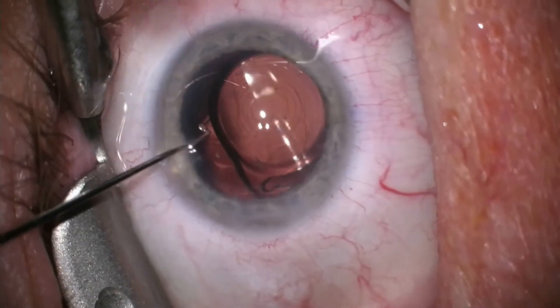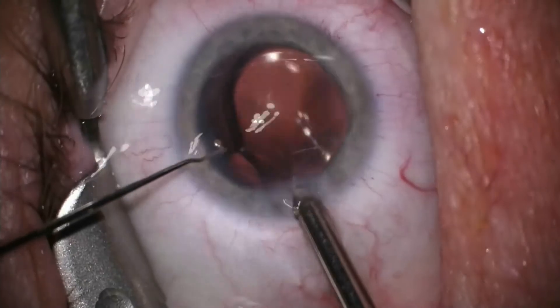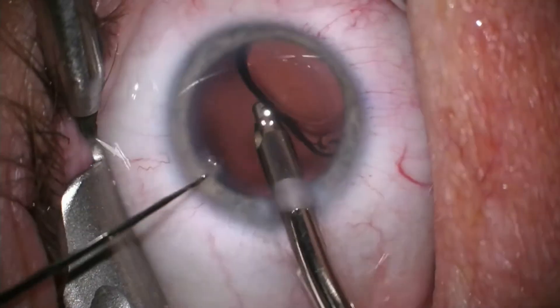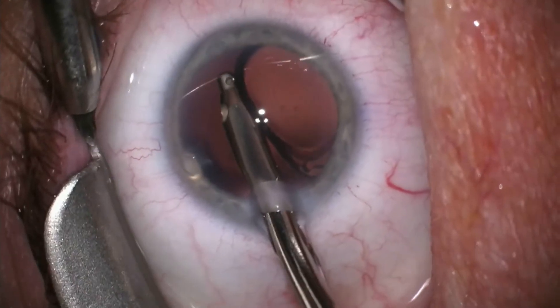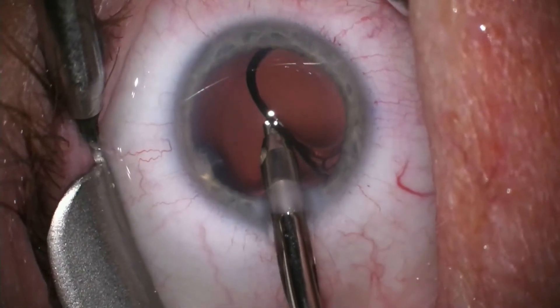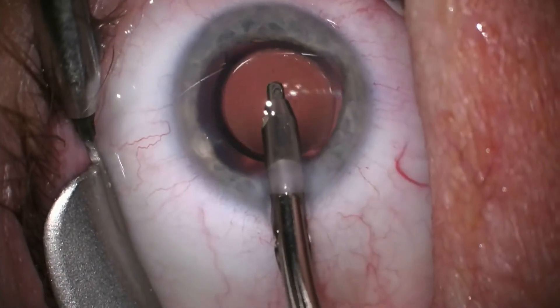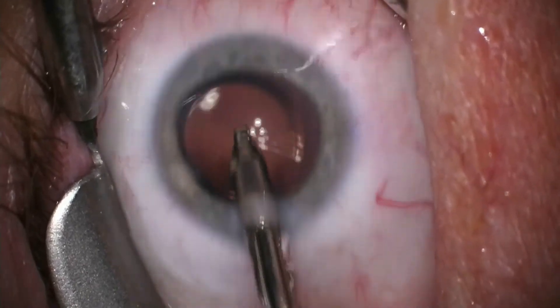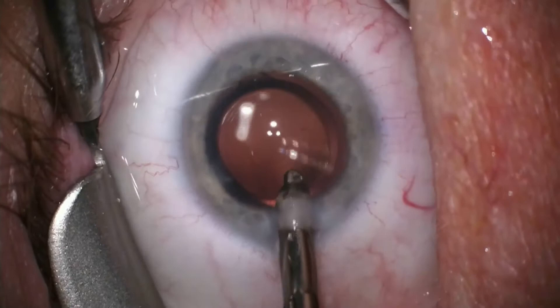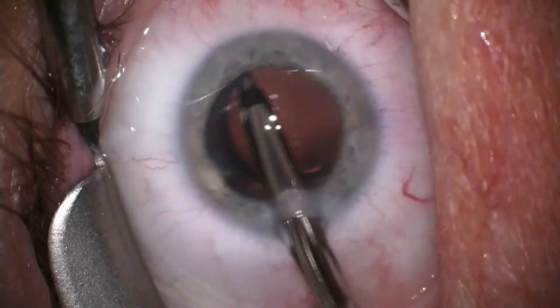There are also four dots above and below that mark the axis of the astigmatism. I am now aspirating the gel from below and then above, as well as rotating the lens to our planned axis of astigmatism, which in this case is to line it up with the incision.